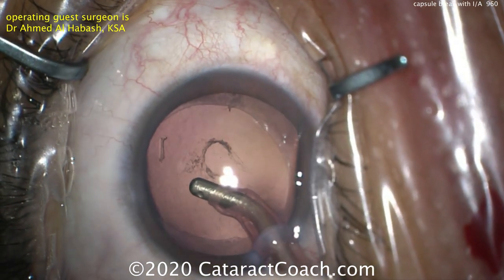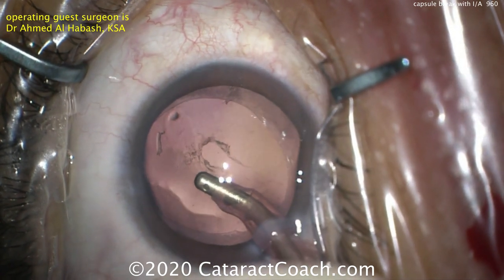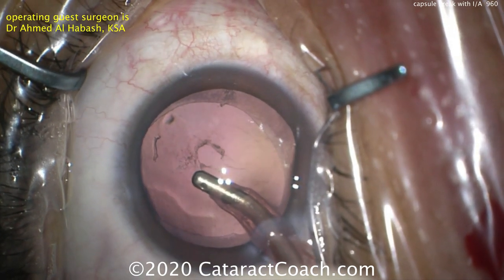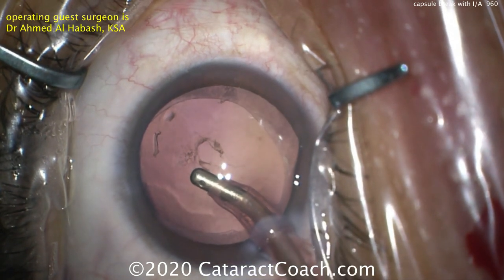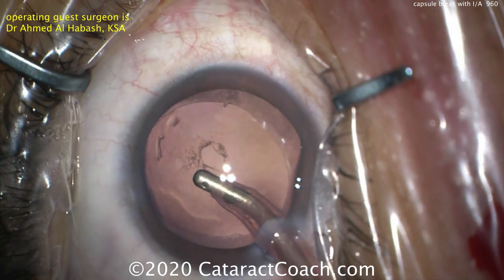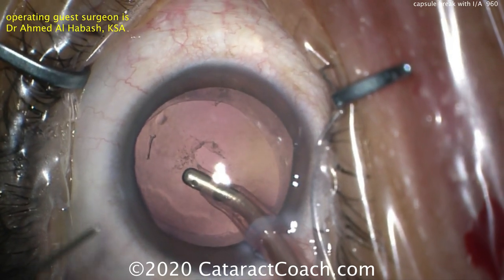Now what? Stay in position one — very important. Keep your foot on position one, keep the eye inflated. Do not let the anterior chamber collapse. Do not pull the phaco probe or the IA probe out of the eye at this point. That's going to keep your anterior hyaloid face intact and prevent prolapse of vitreous into the anterior segment.